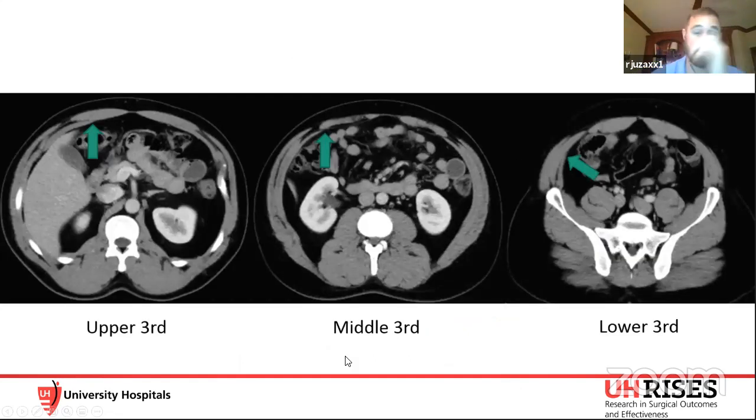This is that very nice patient the ED sent me. He got great images because he was a thin, muscular guy with a small umbilical hernia. Rectus muscle, transversus inserting almost exactly as depicted in that picture, and then migrating laterally as you get lower. Kidneys are here. We're in the mid portion of the abdomen. We're migrating towards the lateral abdominal wall. And then as we get down to the inferior third of the abdomen, the transversus muscle is all the way lateral, away from the semilunar line.